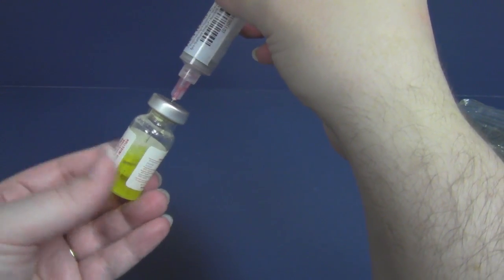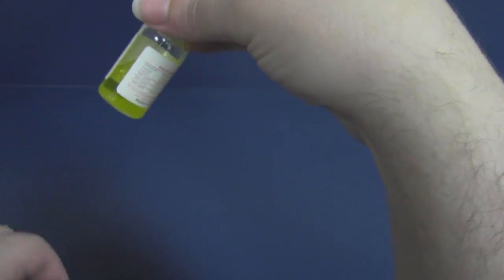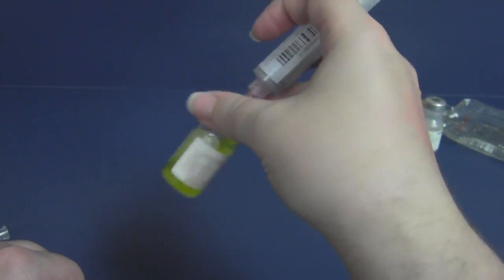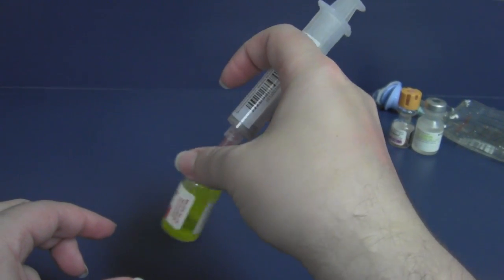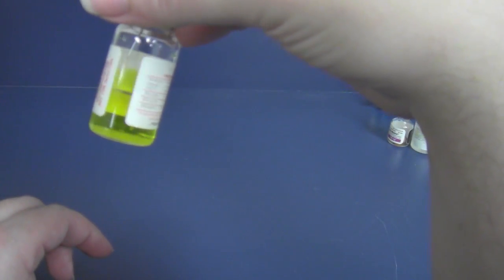Now I can remove my needle or I can leave it in there, but I need to mix up my medication. So I want to make sure that I have no chunks of medication floating around. It should be nice and clear. So this medication is bright yellow, but it should be clear otherwise with no floaties.